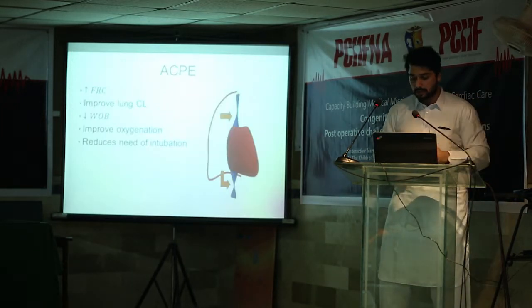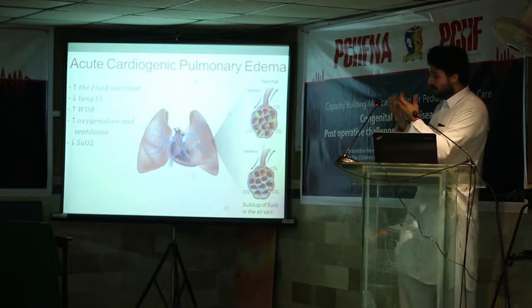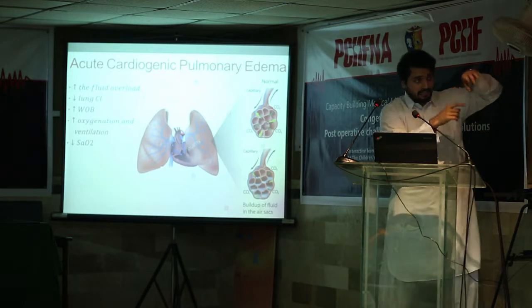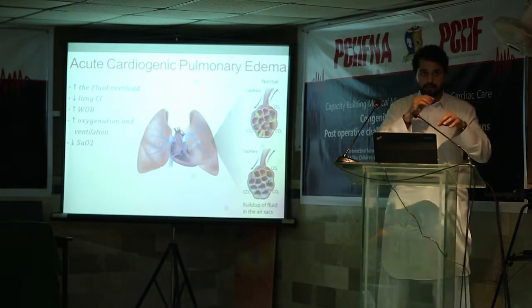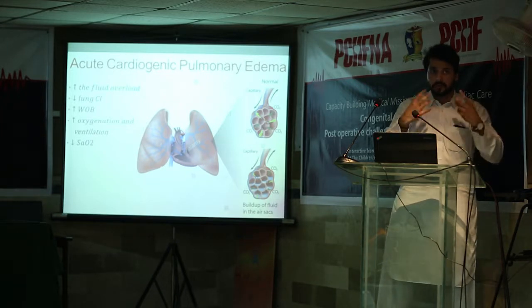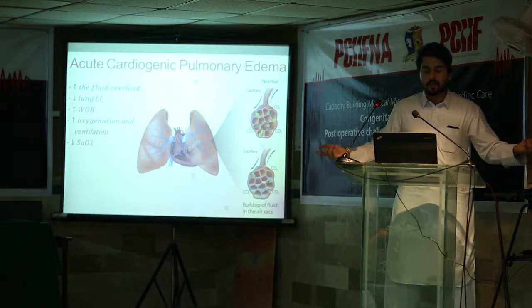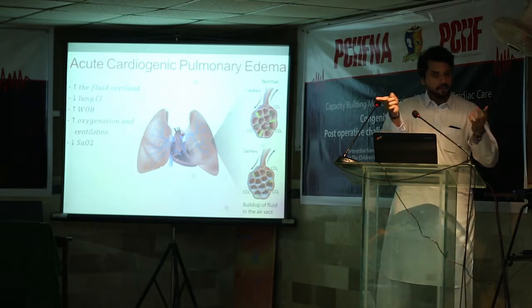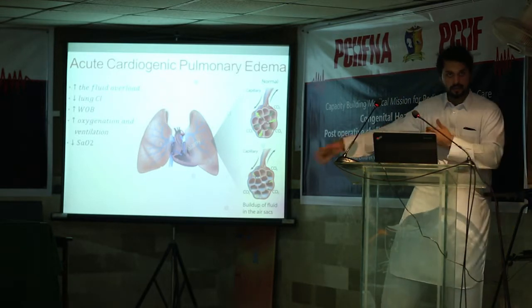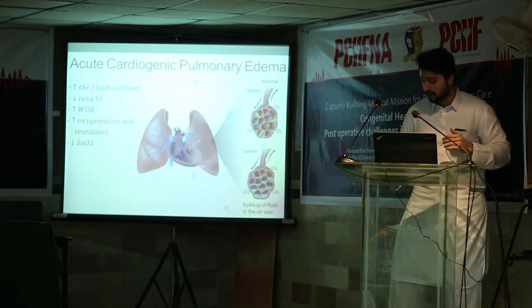By applying NIV, what will happen? In the upper picture, with NIV, we will put positive airway pressure, especially the CPAP. So the positive pressure will push the fluid away from the alveoli toward the alveolar-capillary membrane. So now the surface area of the alveoli itself is bigger, which is better for gas exchange, better for oxygenation. So the patient slowly, usually in 1 to 2 hours, will feel more comfortable with the NIV. Imagine if you don't have NIV, what will happen to this kind of patient? Intubation, because they will be severely tachypneic, with high CO2, and high flow nasal cannula will never work for them. So intubation. But alhamdulillah, we have NIV. Within 2 hours, with giving Lasix and diuretics, with NIV, he will be fine without the need for invasive intubation.